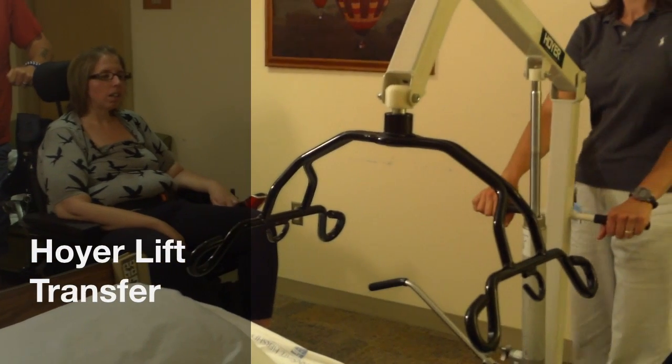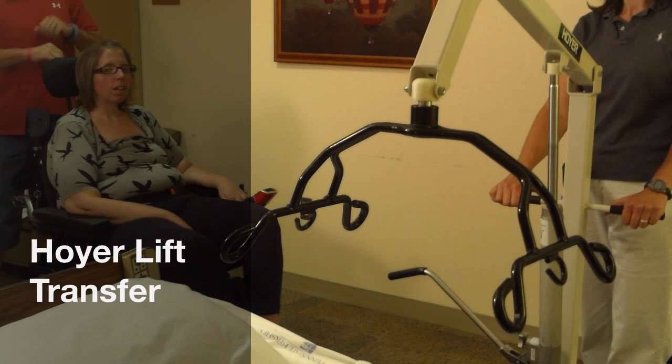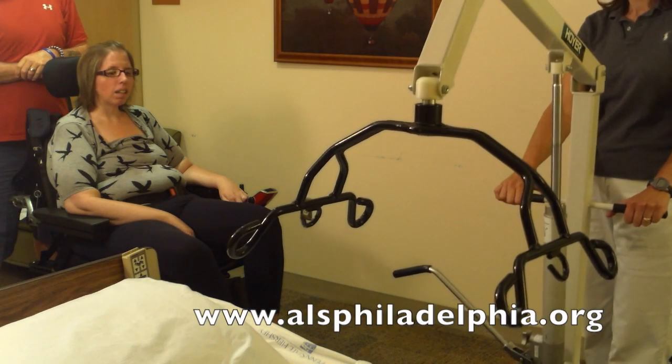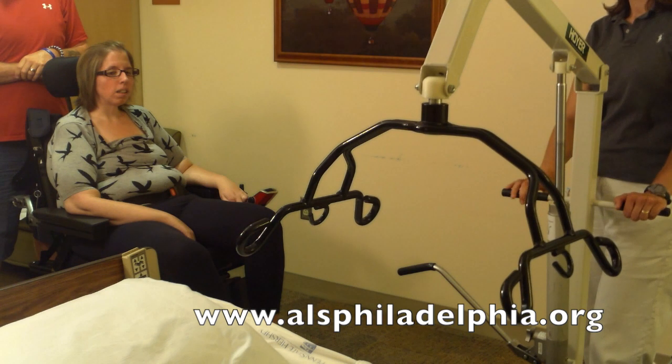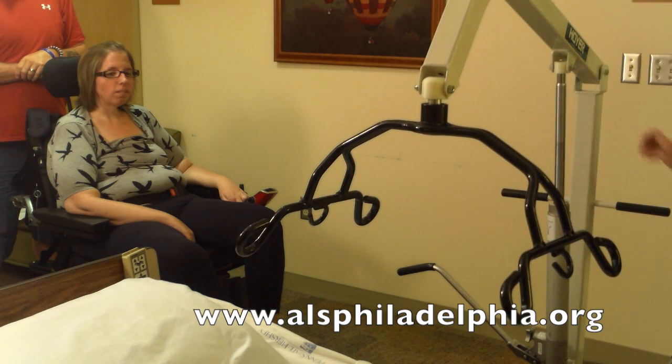This is a caregiver training video for a Hoyer lift transfer. Keep in mind that you will already have an in-home physical therapy evaluation and assessment to help you with this transfer. This is just a review for other caregivers in the home. You will start with a Hoyer lift, and the physical therapist who has come into the home will already have assessed your home situation and your home environment.